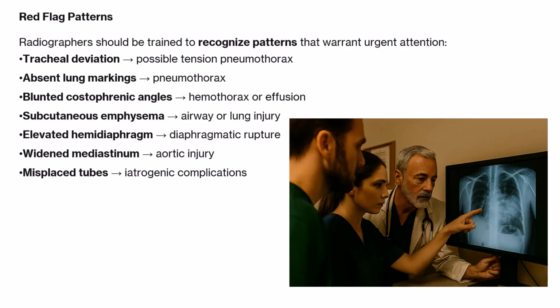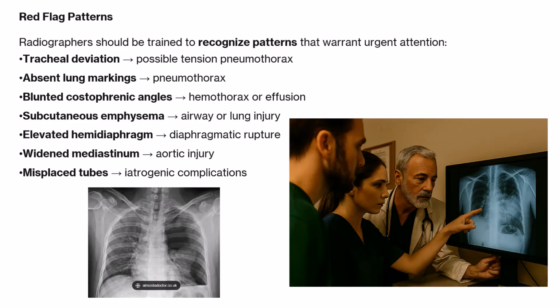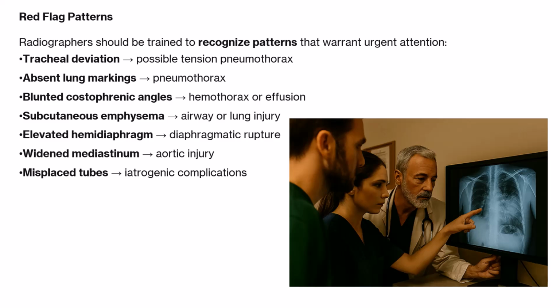You must master the accuracy of putting markers in the correct place and having enough documentation about the time and orientation of the anatomy in the room. If you see signs of tension pneumothorax or other misplaced lines, alert the physician immediately and use high kVp for penetrating injuries or dense foreign bodies and adjust the techniques for casts, dressings, or body habitus accordingly.